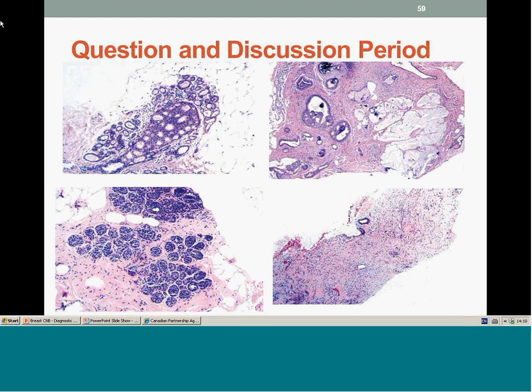So I think the work by Stuart Schnitt, Boston group, are good. And rather than try to go through in a detailed fashion, I would recommend that you review Stuart Schnitt's work on FEA. But basically, FEA is a lesion in which you see significant atypia. And the trouble, of course, as you know, is that it's the eye of the beholder and somewhat subjective. I would recommend you review some photos of those kinds of lesions, and I show it around.